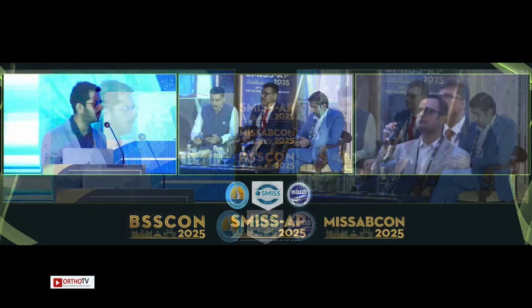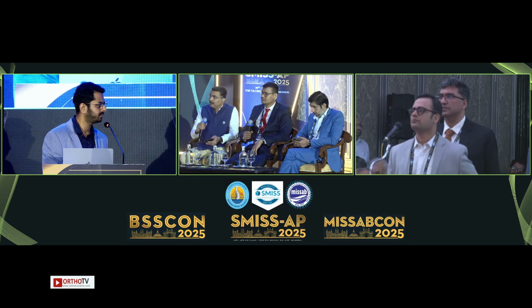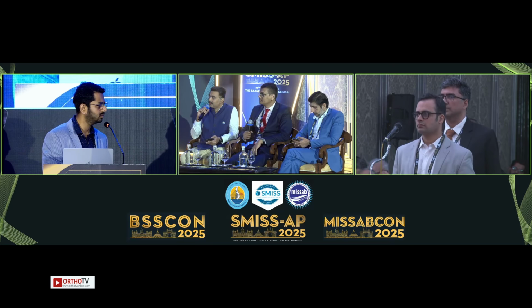So in how many of these patients have you actually given injections and then made a clinical diagnosis before you go and decompress symptomatic levels? In few probably, sir, but there's no documentation as such, particularly how many cases we did that. But in our routine practice, we do subject patients to injections.